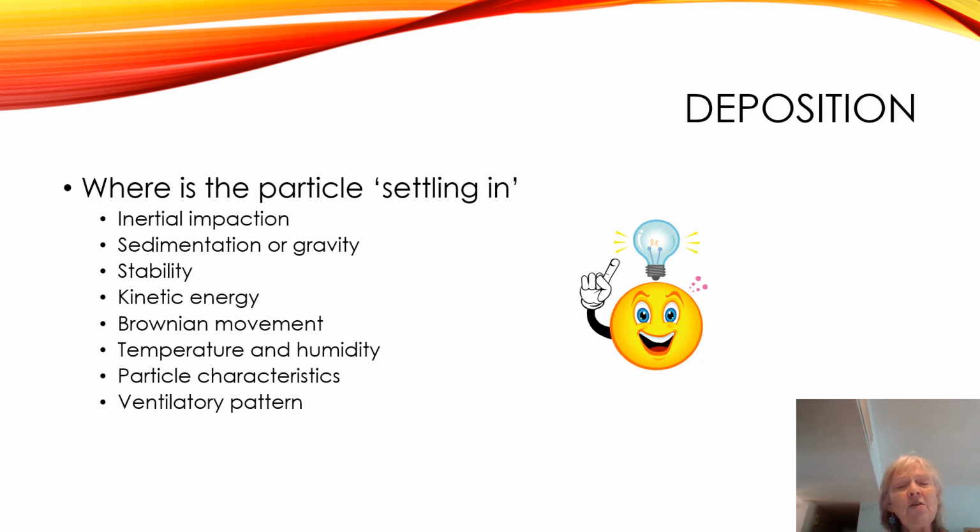Temperature and humidity are a big one. If your medication is cold, your deposition is going to be much lower because the particles are going to move much slower at that point. So, especially with your aerosols, your MDIs, your DPIs, you don't want to store your medication in the freezer, because before you can take it, you need to warm it up.